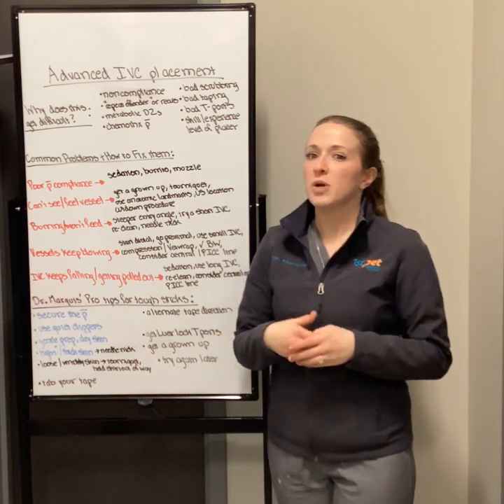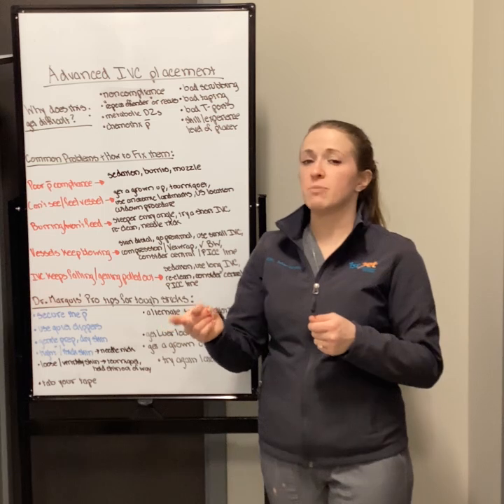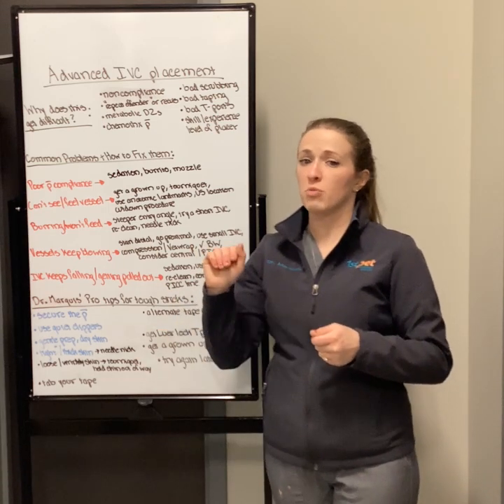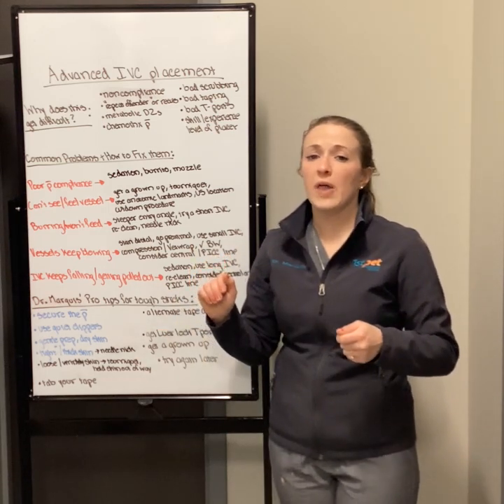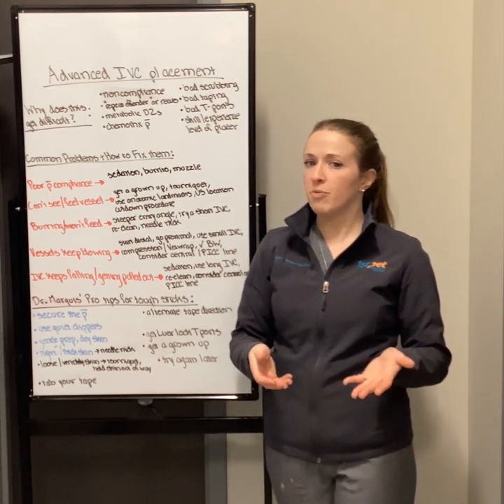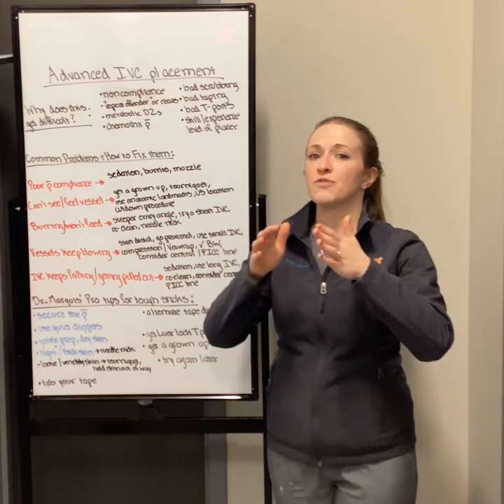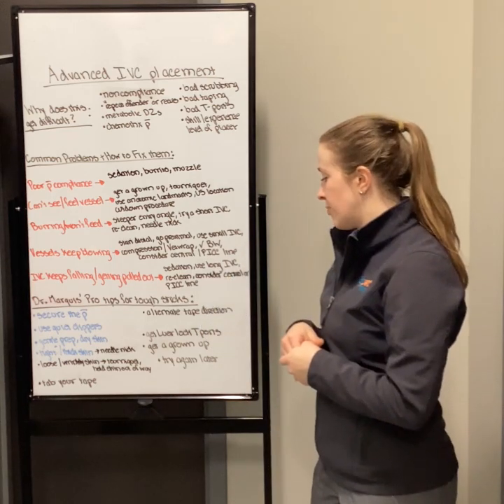So what I would suggest is put your first piece of tape on and maybe flip it to the left, and put your second piece of tape on and flip it to the right. And then if you do something like a security or so-called bra strap or vet wrap on top of your catheter, you can just alternate the direction, and that way the catheter is firmly seated in place.